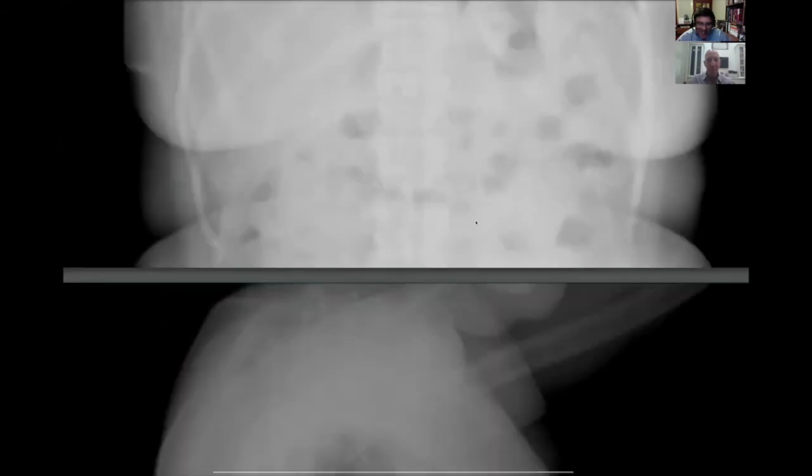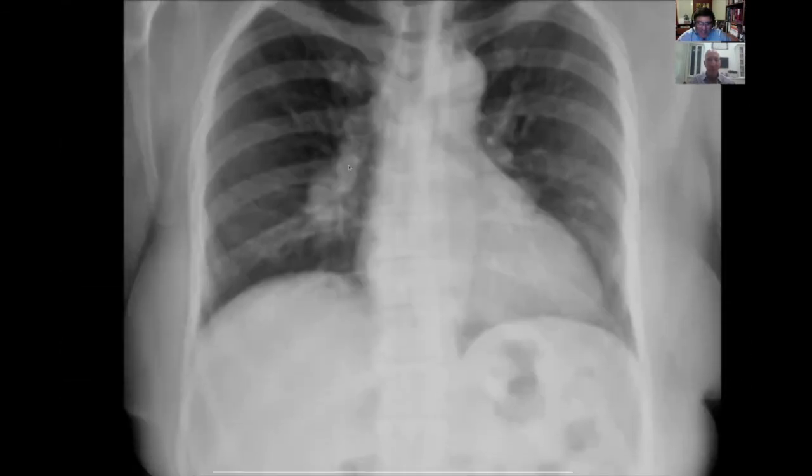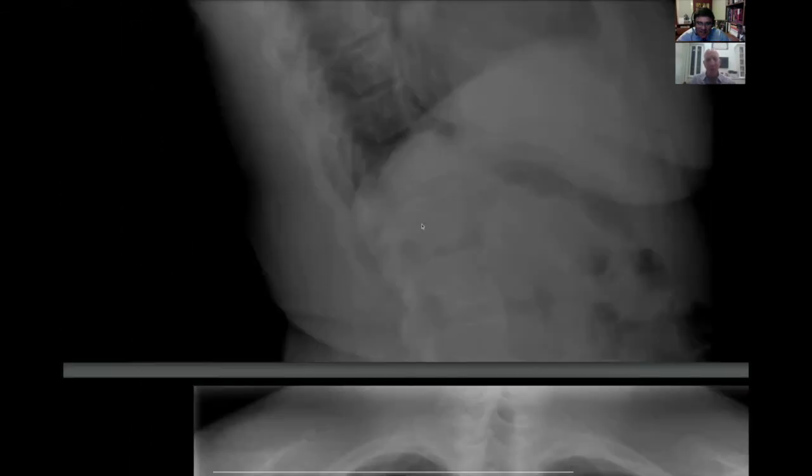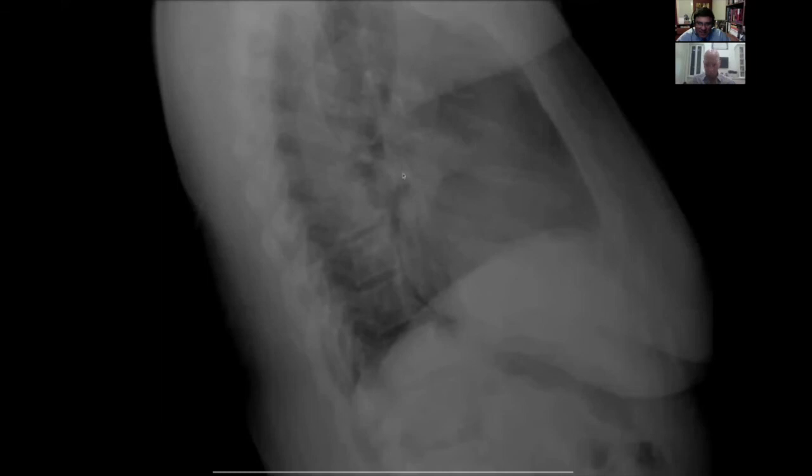And I'll just go back a second to the frontal projection. As you pointed out, you can see the asymmetry, this sort of nodular enlargement, but really sometimes this can be vessels. These can be enlarged vessels or even overlapping pulmonary veins and arteries that can look prominent. But when you go to the lateral view and you see this kind of nodular appearance, this is typical for adenopathy. And in a young patient like this, with that presentation, you start to think of things like sarcoid would honestly be the most common thing. You could have granulomatous lymph nodes like histo, depending on what part of the country you're in, or TB, and then of course lymphoma and malignancies as well.